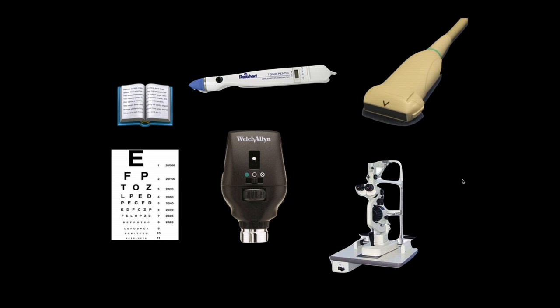I would argue that some of the devices shown in this picture are more difficult to use for an ER physician than the ultrasound probe. Our training is only so extensive, and we get to only do so many views of the retina, and I suspect that you will probably see more eye complaints that you'll be dealing with directly if you're working at a non-academic center once you leave residency, and I have a feeling you'll be more comfortable at times with the ultrasound. So I suggest that you consider using it when you think it could add to your patient's care, help with diagnosis, and communicating with your ophthalmologist.